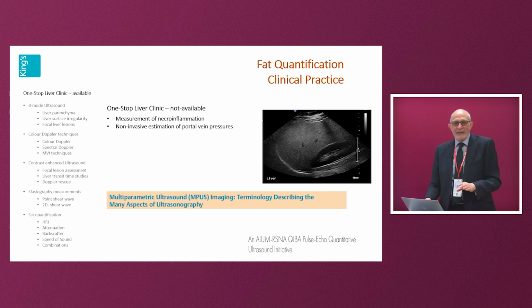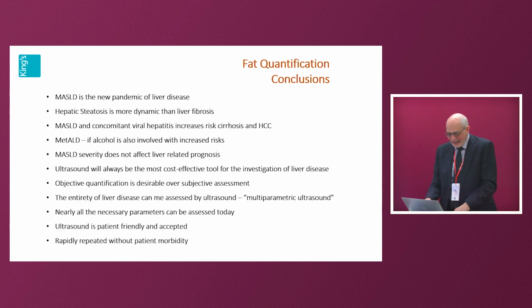You don't need to do anything, and it's cheaper than any other imaging modality. It's more available, and you have people who can do it in primary health care. Why are you scanning someone in your tertiary referral hospital for fatty liver disease if you can do it as a point of care in primary health care and triage the patient there? So it's going to change. And you can't argue it. There are just too many people to be scanned to say no.